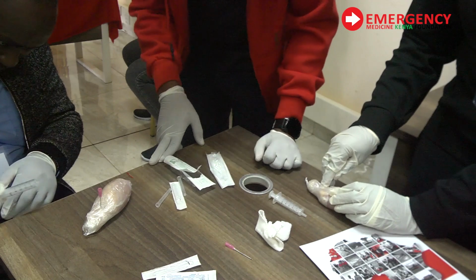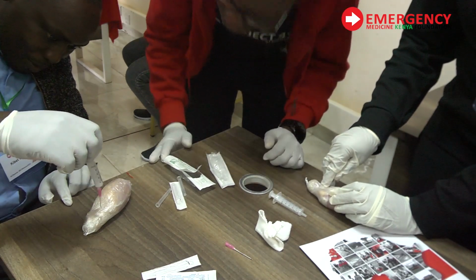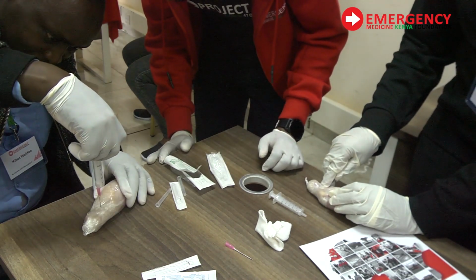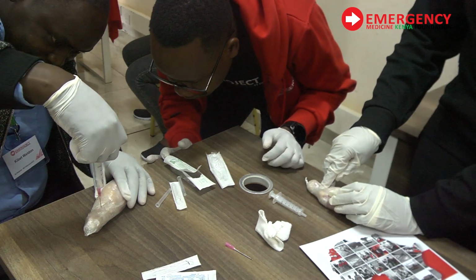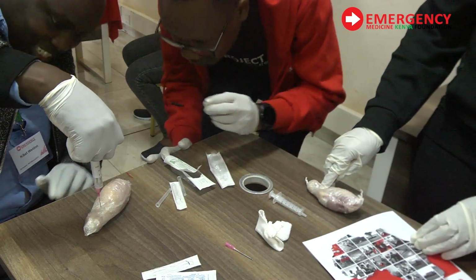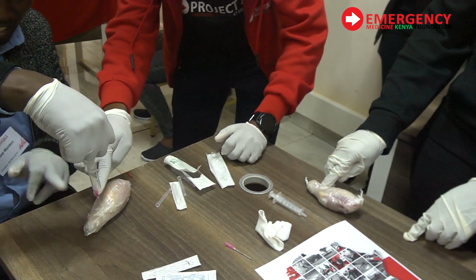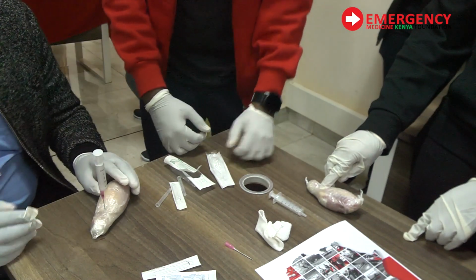They are weak sites. And for the iliac crest, the same. As long as you go to your flat surface, go in. Anywhere, just go in. Here especially is the landmark. Do you have bone marrow in the iliac crest? Yes, because here I can trace where it is.